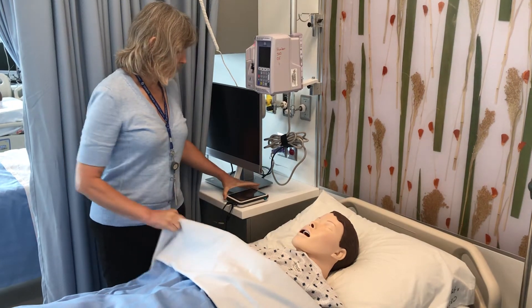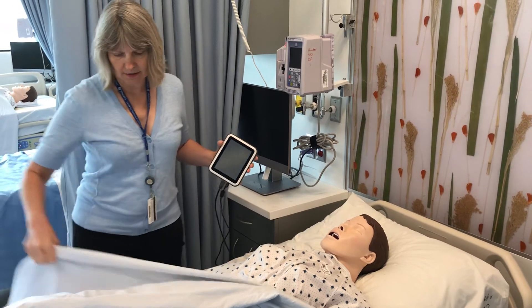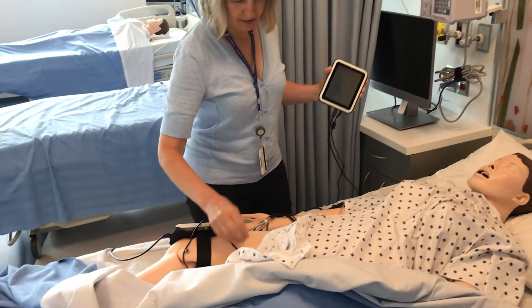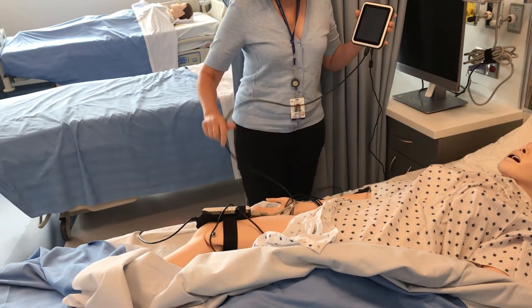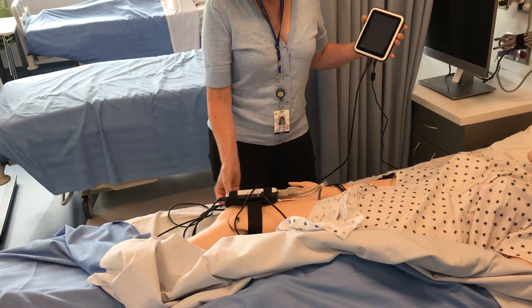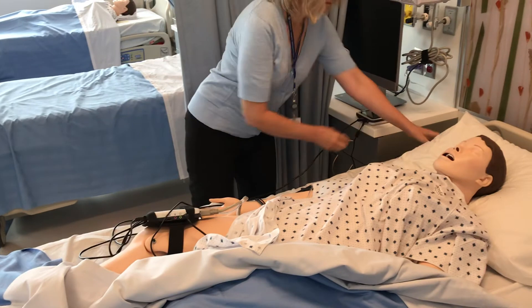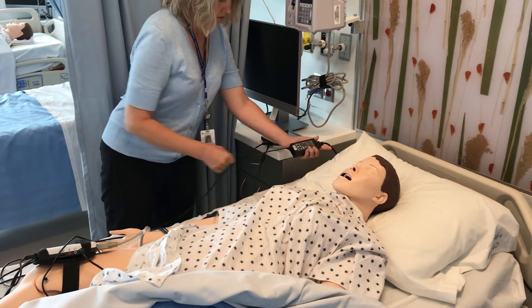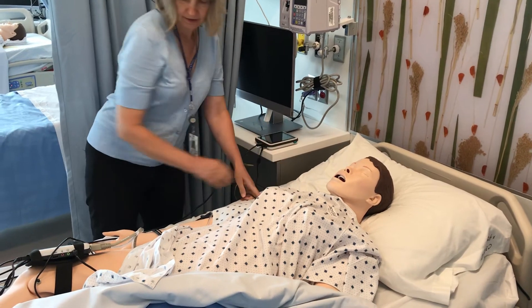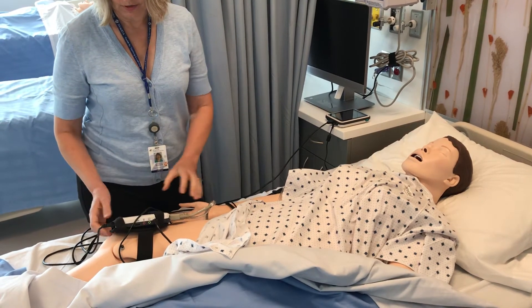Beside the bed is an iPad — the SimPad Plus, as it's called. On the mannequin leg is a link box. They are connected through a number of cords. There is also an outlet connecting power from the wall to the SimPad Plus, and everything needs to be connected well before things work.